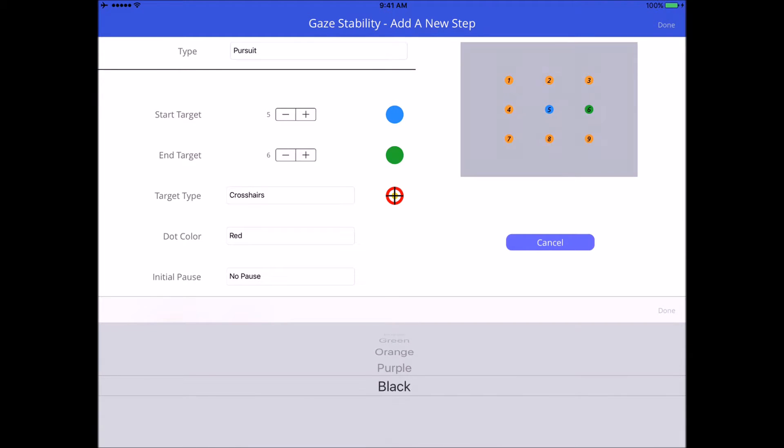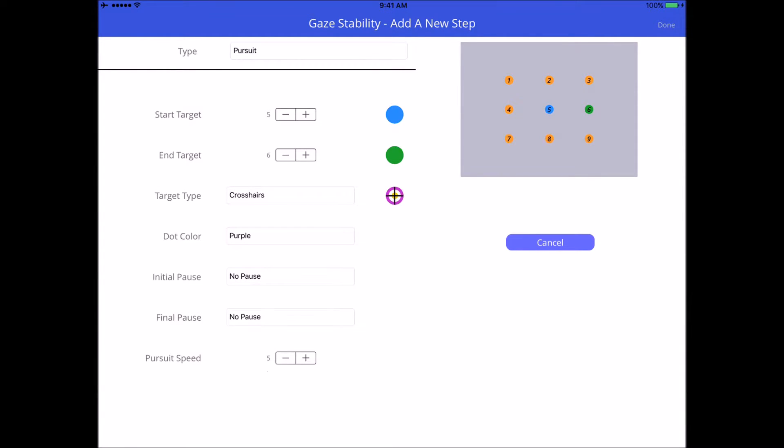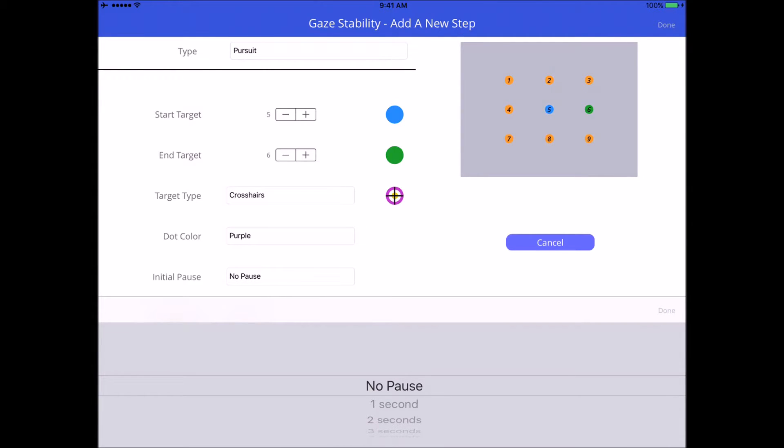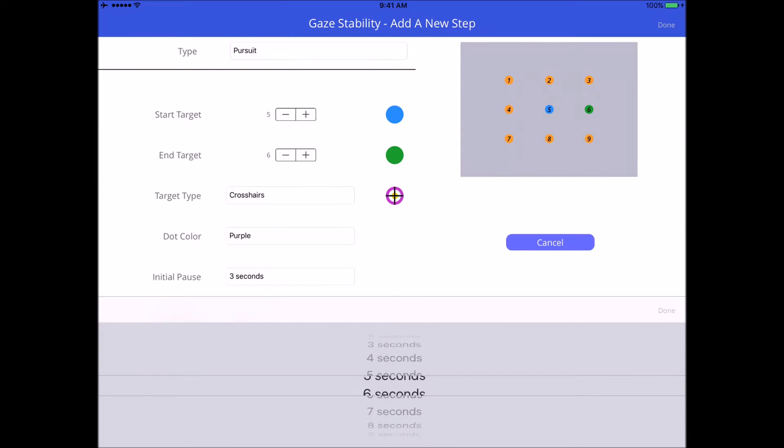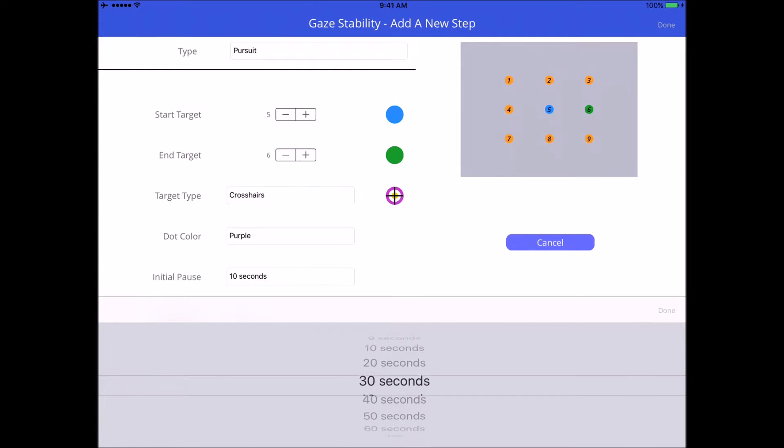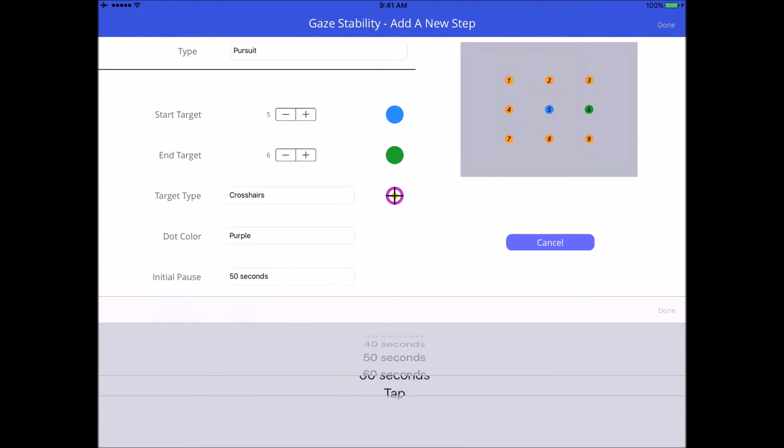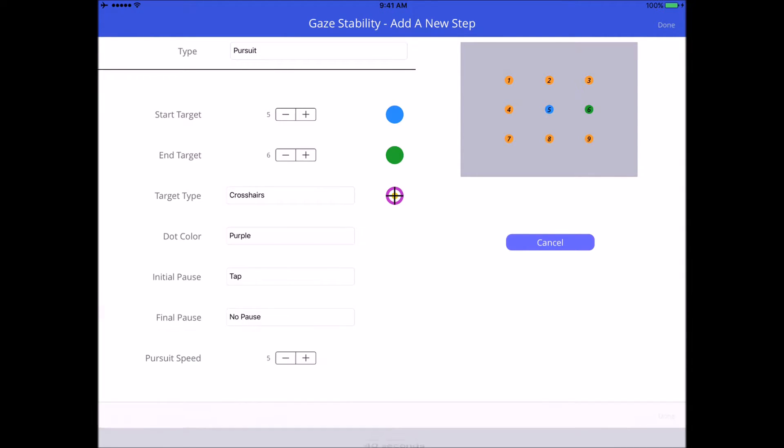That color is red. You can change the color to whatever color you want, you can make it purple if you want. Now the initial pause, this is the amount of time the target will hold before it moves to a second location. You could do no pause which will make it go right away. I never use this one personally but the option is there. Or you can make it a fairly long time so the patient has plenty of time to do their gaze exercise at that central target. Or you can just do tap, and this is my favorite option. The tap option, basically the target will not move until you tap the screen anywhere on the iPad.